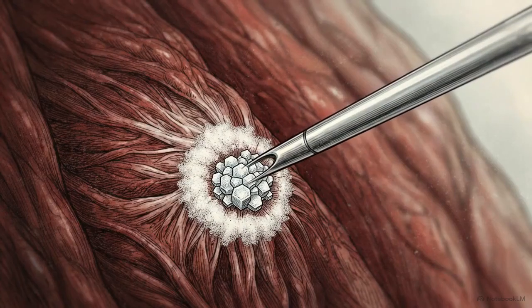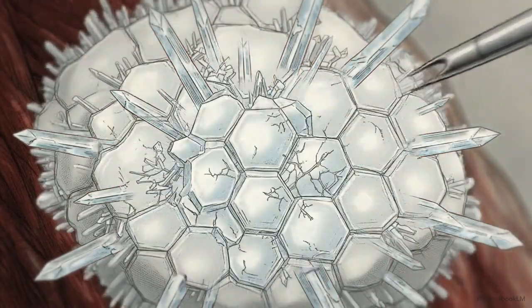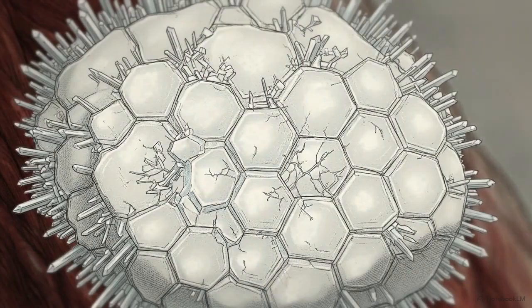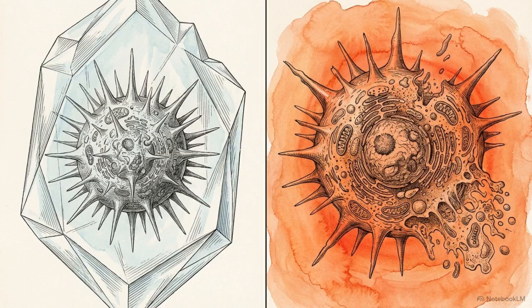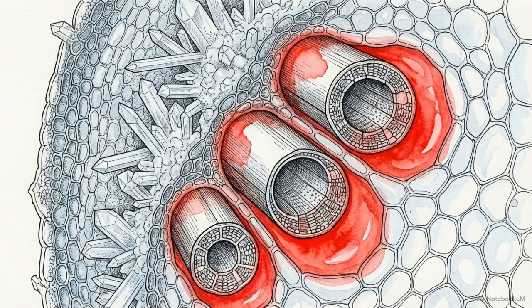Cryoablation shifts the mechanism from heat to extreme cold, using ice formation to destroy the target. This technique uses compressed argon gas. These systems create rapid freeze-thaw cycles. While freezing is visible on imaging, the thawing phase primarily kills cancer cells through cellular lysis. Cryoablation is generally less painful for the patient than thermal methods, often requiring less sedation. However, it carries a higher risk of bleeding because the cold does not cauterize small vessels as heat does.